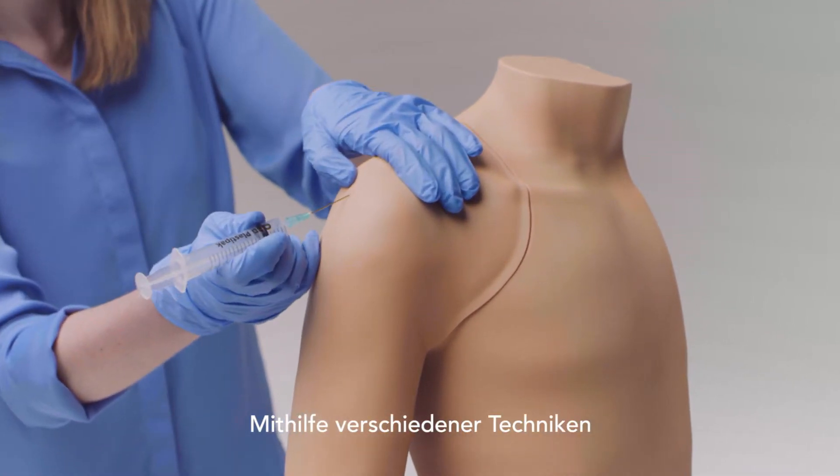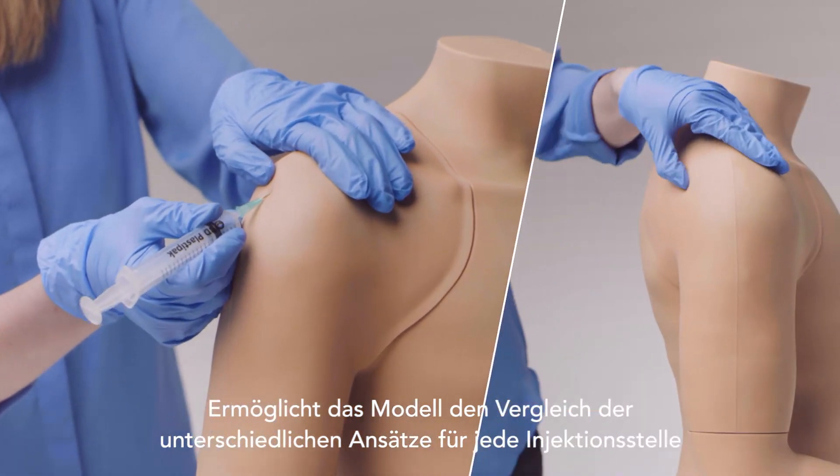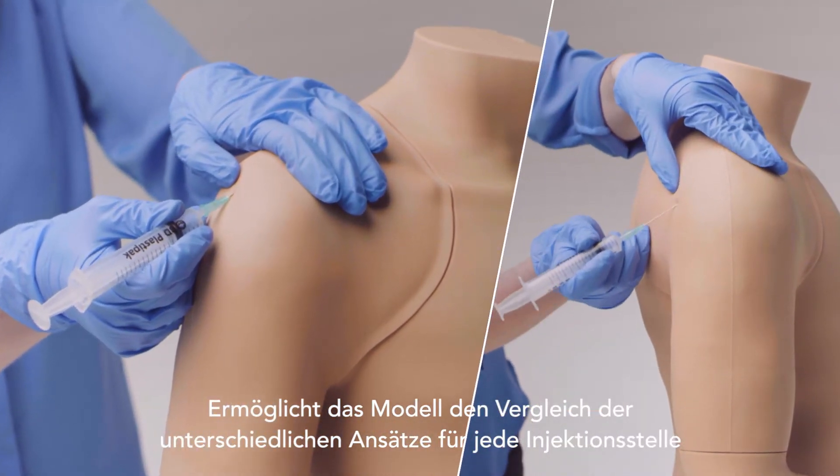Accommodating different techniques, the model allows for the comparison of the varying approaches to each injection site.